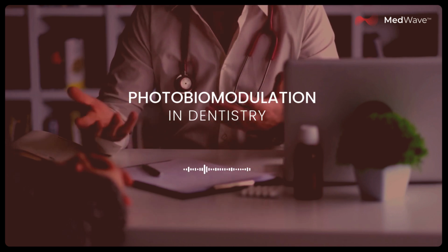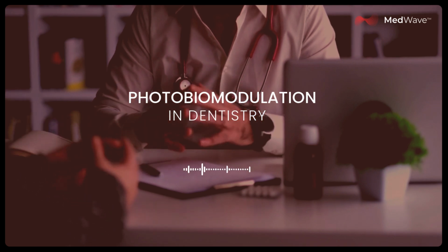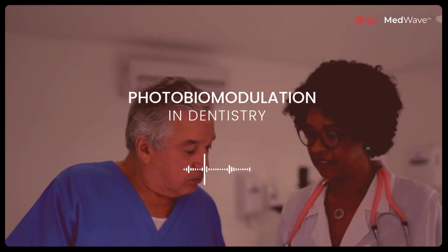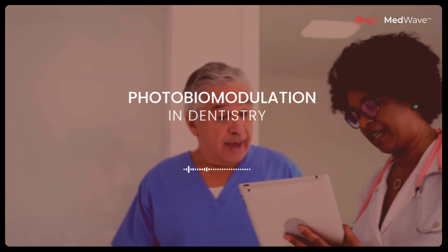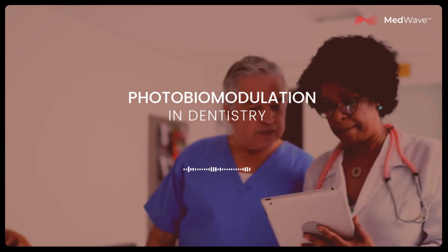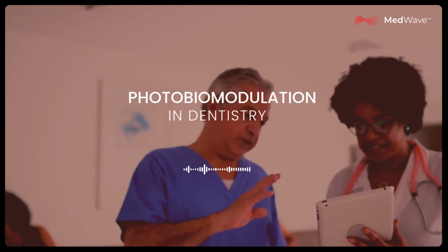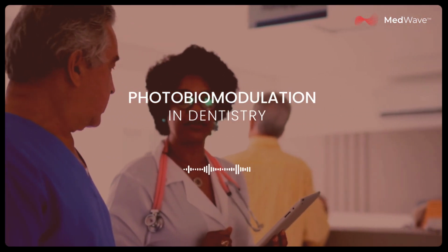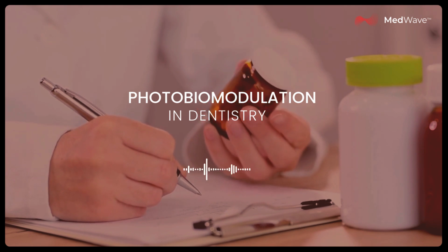Wow. And that's not all. There's another study that examined the use of a 445 nanometer diode laser during the process of uncovering titanium implants. So this is after the implant has been placed and is ready for the tooth to be built on it. Exactly. It's like the second stage of the implant procedure. What they found was that using this specific laser in a non-contact mode significantly reduced the temperature increase in the implant during the uncovering procedure. And this is a big deal because excess heat can damage the surrounding tissues and slow down healing. So this is helping to keep things cool and minimize trauma. Exactly, and potentially lead to faster healing. Okay, that makes a lot of sense. I'm starting to see why there's so much excitement surrounding photobiomodulation. And that excitement is definitely justified.